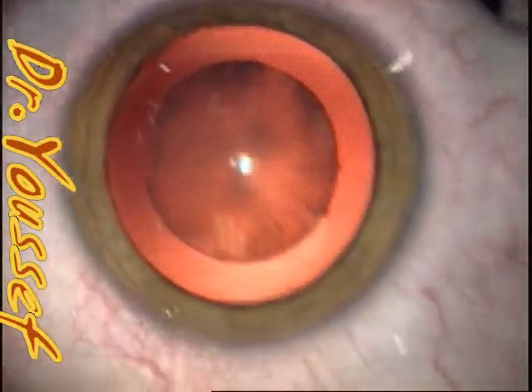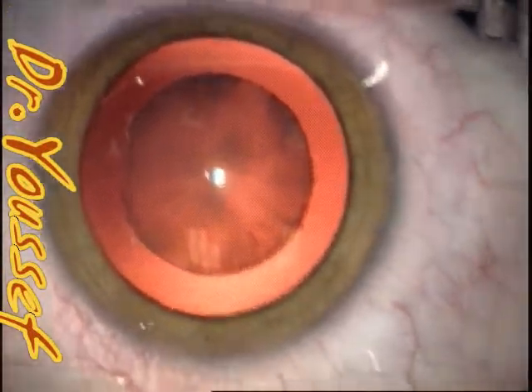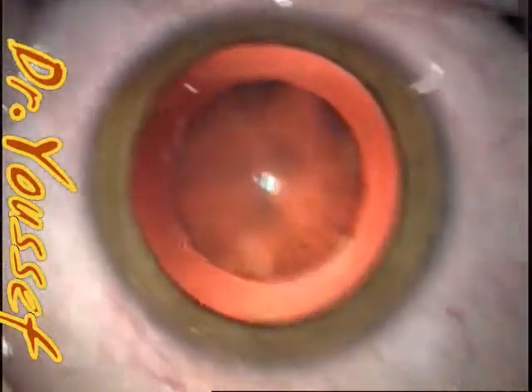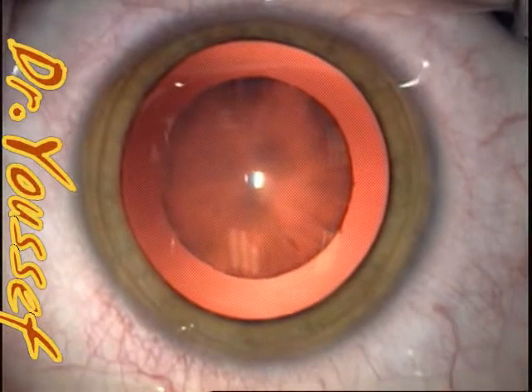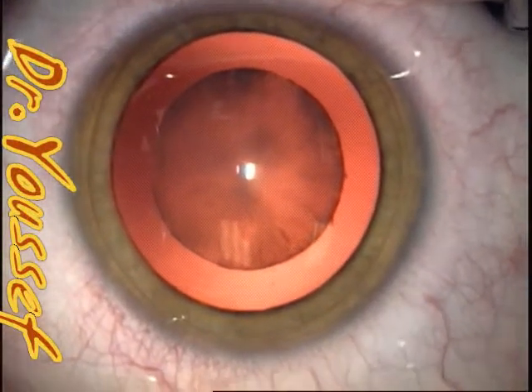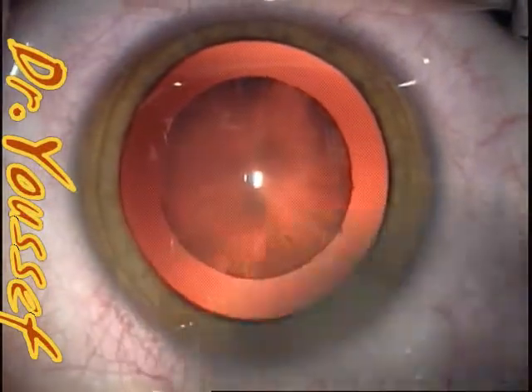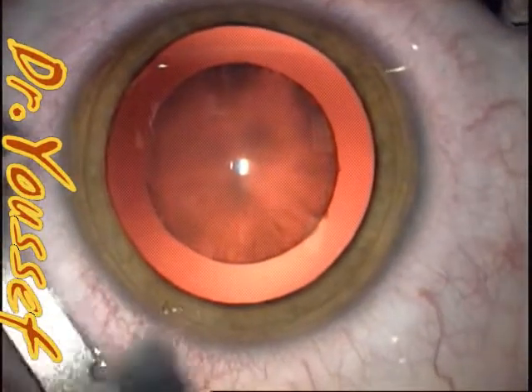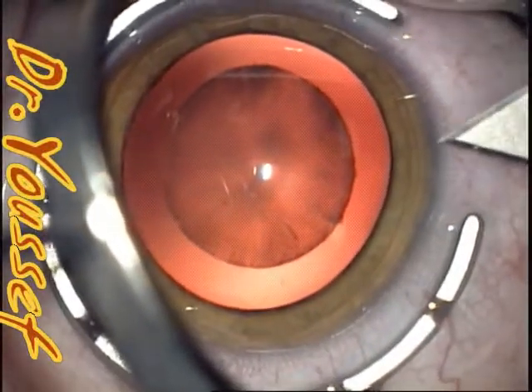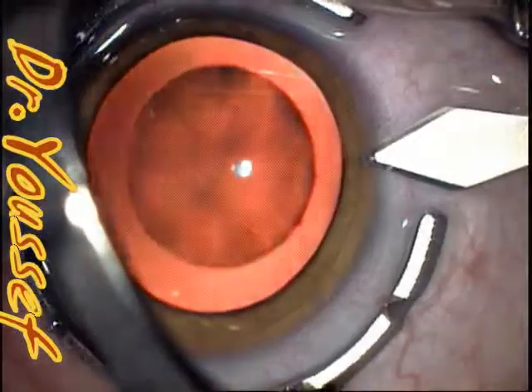Hi, I'm Dr. Youssef. I'll be presenting this case of lamellar developmental cataract. This kid is six years old and started to develop a diminution of vision. He's known to have esotropia. His glasses are plus six, and his intraocular lens power was calculated to be 36.